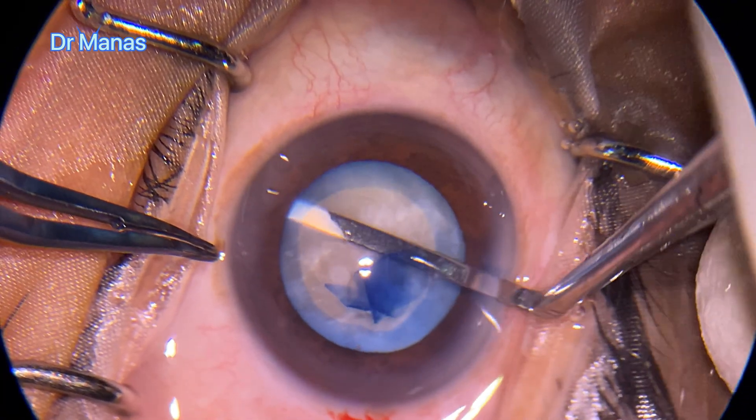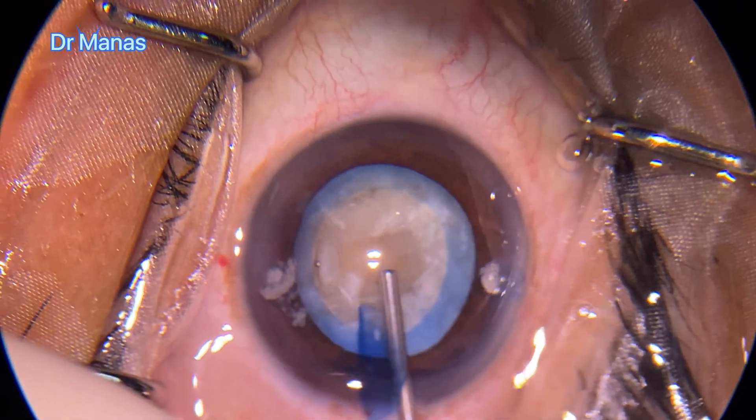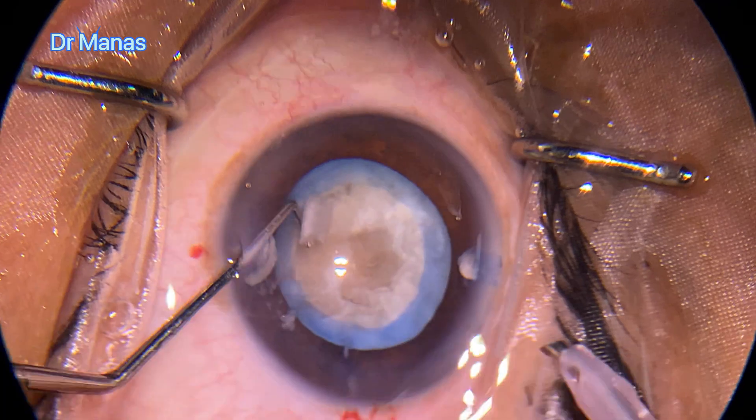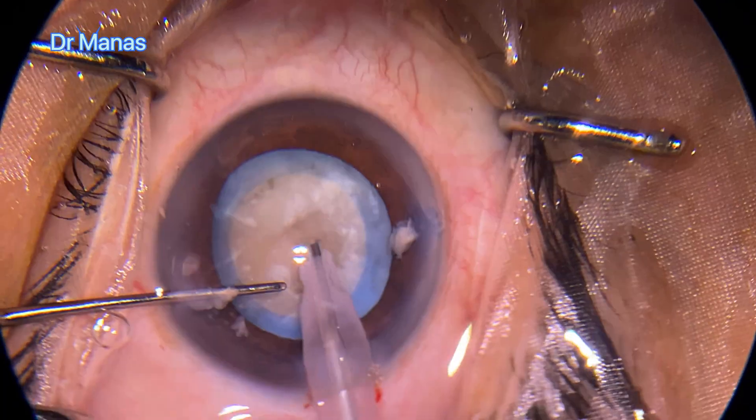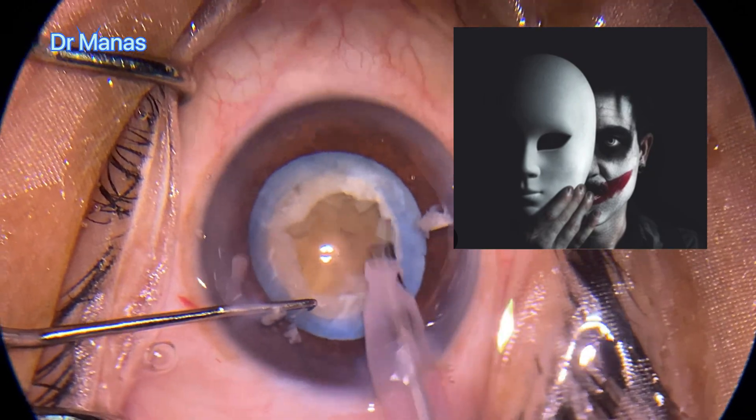In such cataracts, I usually avoid doing hydro procedures. Using the spatula to separate the cortex from the capsule, I introduce my sharp chopper. You can see that as I have shaved the superficial cortex, the mask has gone and the real picture of the cataract has come out.